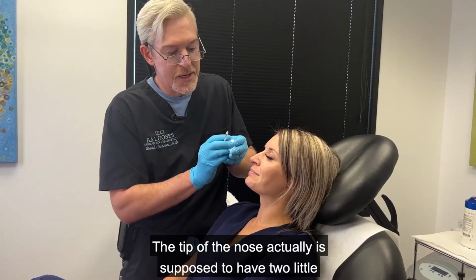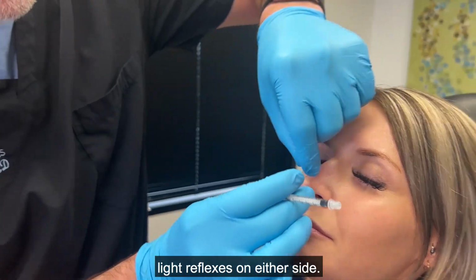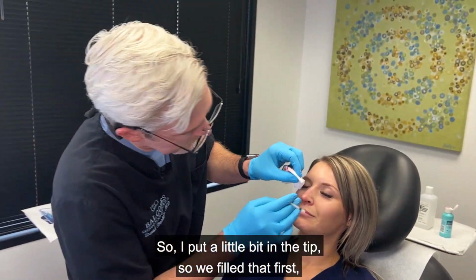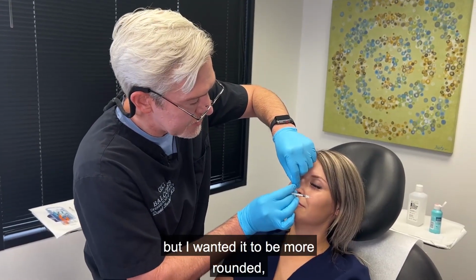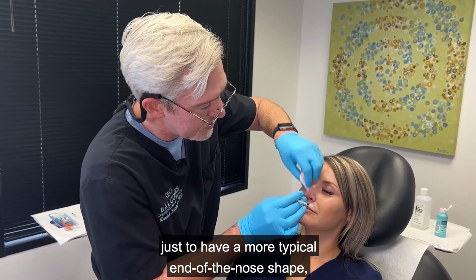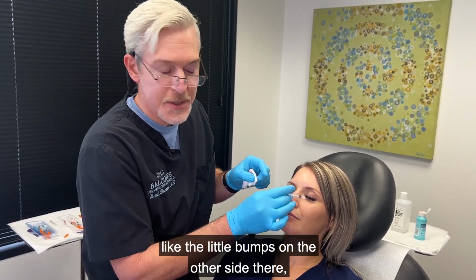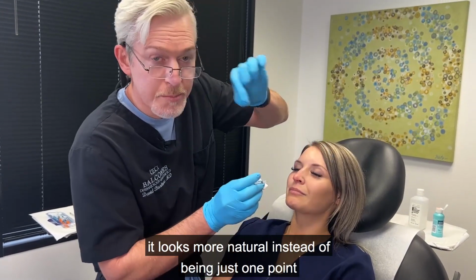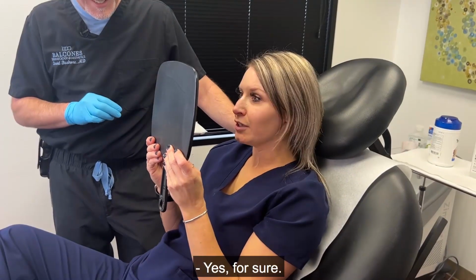The tip of the nose actually is supposed to have 2 little light reflexes on either side. And so I put a little bit in the tip, and so we filled that first, but I wanted it to have a more typical end of the nose shape. If you have a little bit of light reflex, like the little bumps on either side there, it looks more natural instead of being like just one point at the end. So you can see a difference. Yes, for sure. It's subtle.